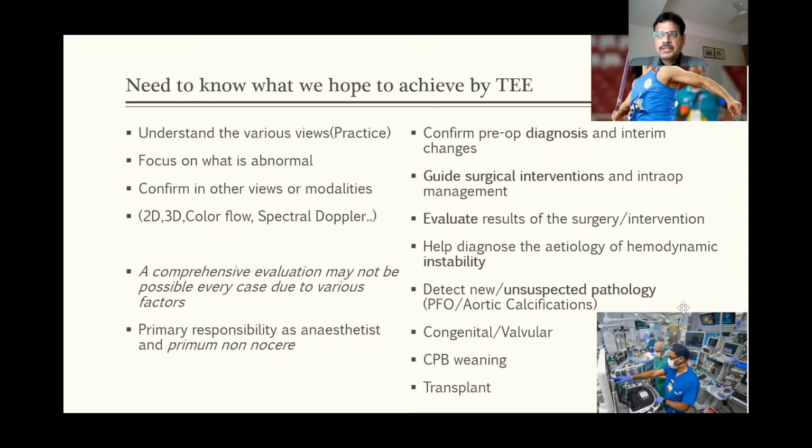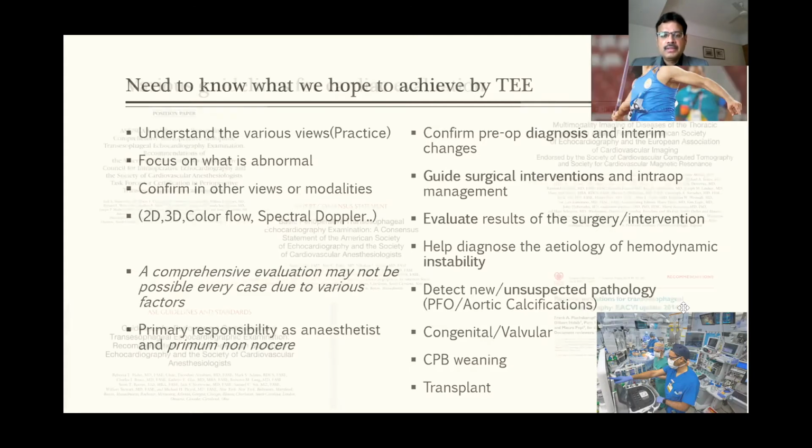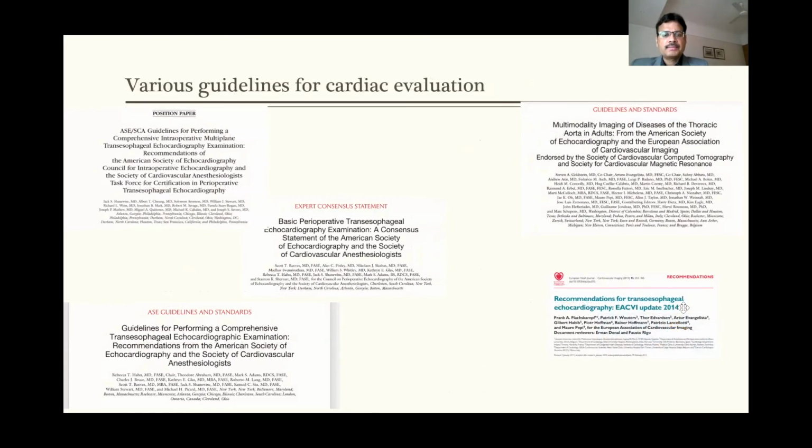But understanding the comprehensive use is just the first step in becoming an expert. If you want to achieve what you set out to do, we need to practice. We need to focus on what is abnormal and normal and confirm in other views and modalities. Throughout this session, you're going to see the utility of 2D, 3D, color flow, and spectral Doppler strain, for seeing that the patient is put on the right path of diagnosis and recovery. But first, we need to understand that no harm should come to the patient by implementing this extra modality of monitoring.